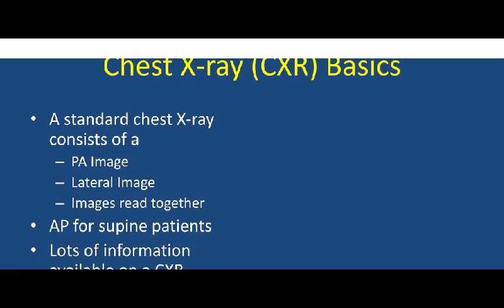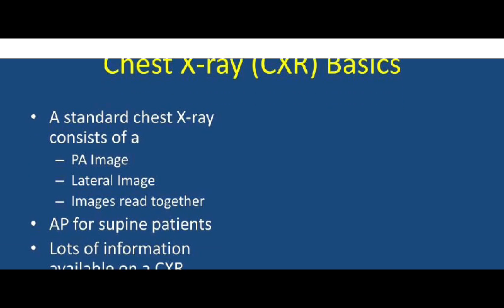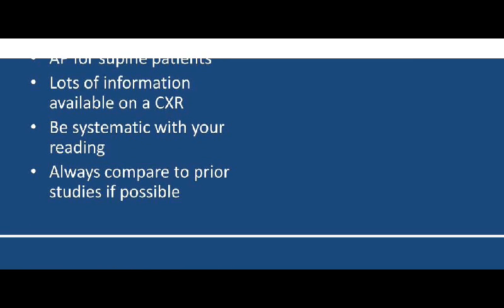So we know that in a standard chest X-ray, we do PA. PA is the basic projection, then lateral for foreign body, which you said in class. Then you can do AP supine for patients who are immobilized. Remember, we do AP for patients that cannot stand to obtain a PA or a lateral. Most times we do a lateral shoot-through just in case we can't place the patient for the basic lateral projection.